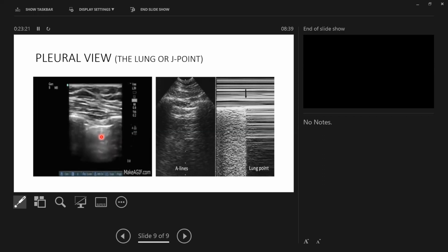Now, of course, it depends on the context as well. You have a massive polytrauma patient, and you see that there is a pneumothorax. I wouldn't now go step by step. Rather put an IC drain and be safe, because this patient can complicate very quickly.